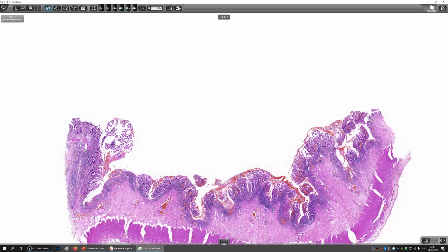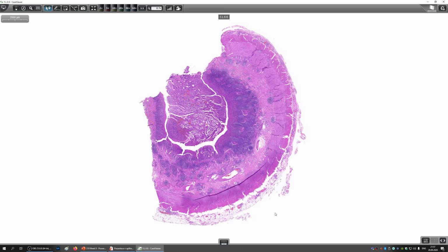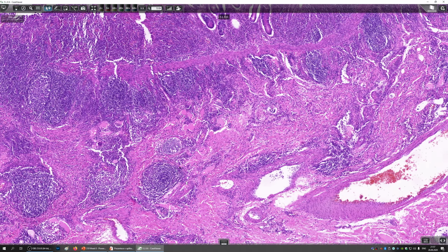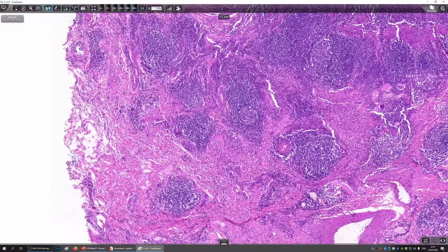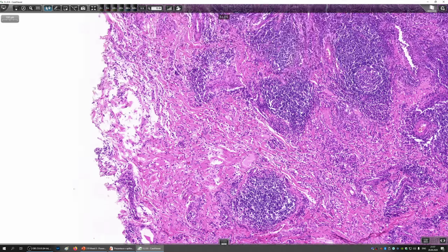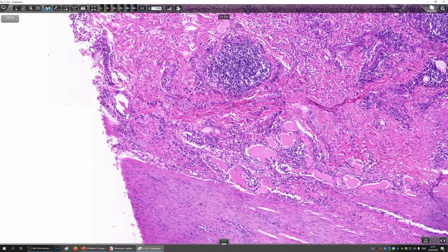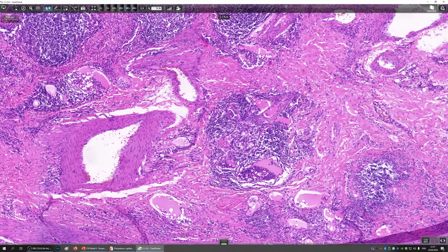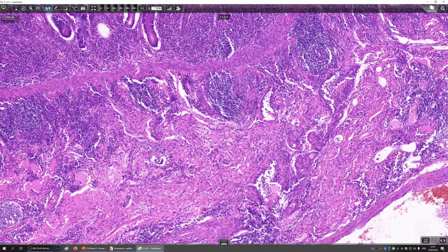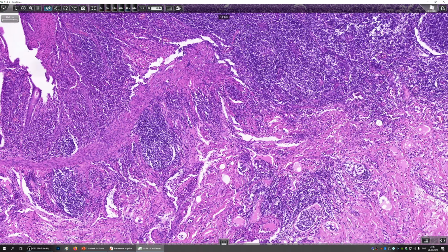Alright, I think I will just jump back to the previous slide for a second because I forgot about something. I need to tell you that in Crohn's disease, another thing which you can see are granulomas. So now I'm just going to check whether we have granulomas here. Those granulomas are different from tuberculous granulomas and different from sarcoid granulomas that we have already talked about before. You get them like 50-50, so in 50% of the cases you have them, in 50% you don't.